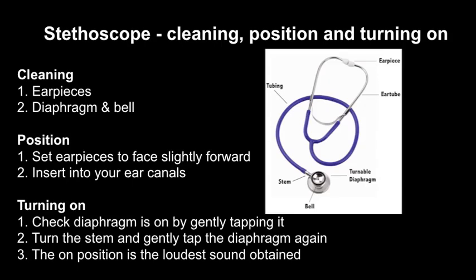It is vital that you familiarise yourself with the use of a stethoscope, as poor technique and faulty equipment may result in an inaccurate blood pressure reading. Prior to use, ensure that the earpieces, diaphragm, and bell are all cleaned in adherence to infection control precautions. Set the earpieces to face slightly forward and insert into your ear canals to ensure correct position. Ensure that the diaphragm is on by gently tapping it. Turn the stem and gently tap the diaphragm again — the on position is from the loudest sound obtained.